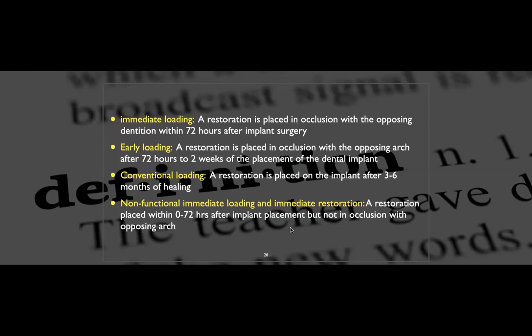The last portion is non-functional immediate loading, or immediate restoration: the restoration is placed within the day of the surgery up to 72 hours after implant placement, but not in occlusion with the opposing arch. Most of the cases, I want to say 85 to 90% of the cases that I do, are that.